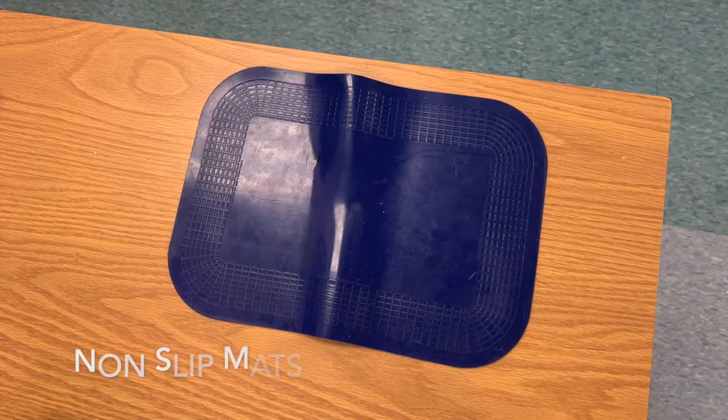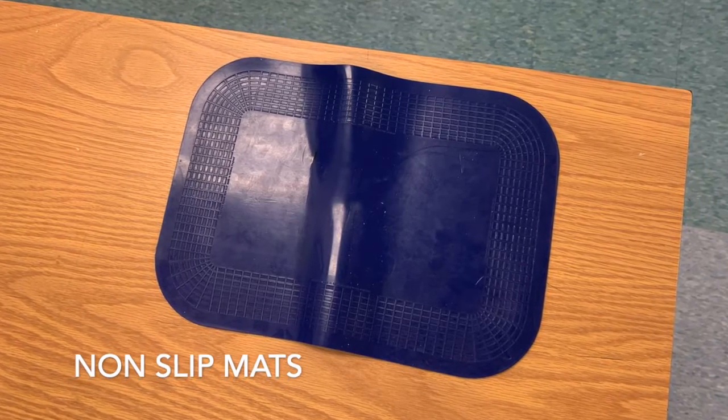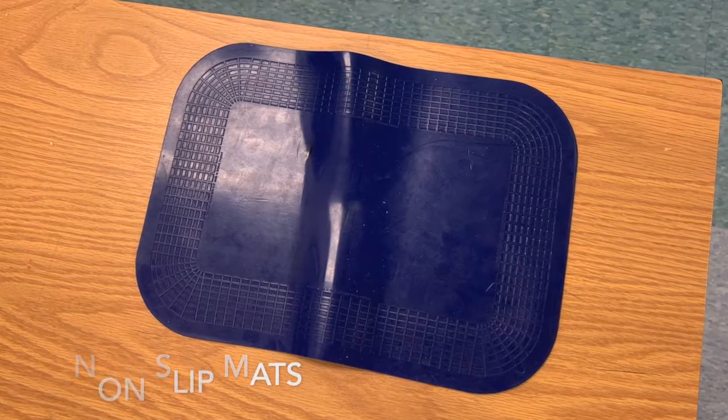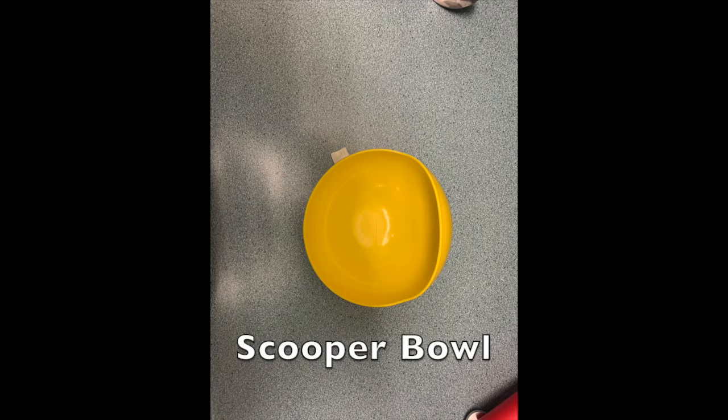Non-slip mats provide increased gripping power. These gripping materials provide a secure surface that anchors items to tables and prevents them from sliding. The scooper bowl has a high rim and reverse curve on one side, which aids in scooping food onto a utensil without spilling.